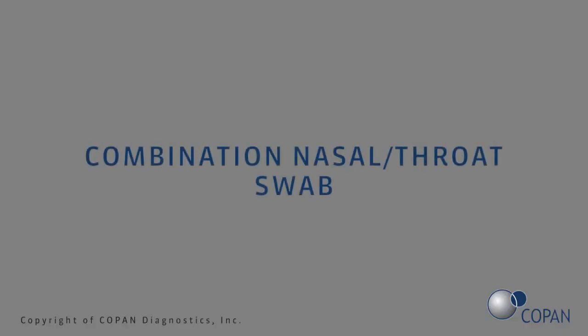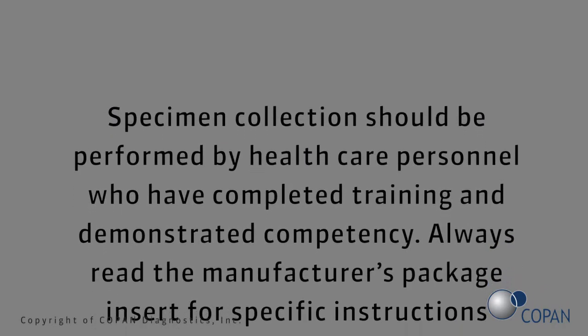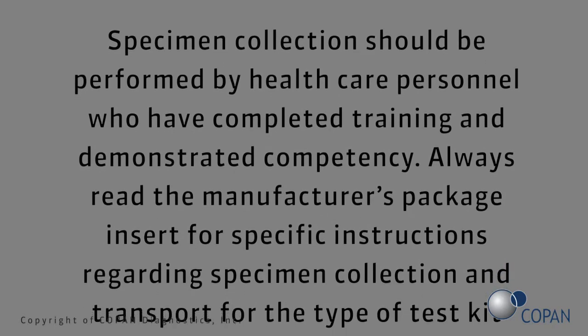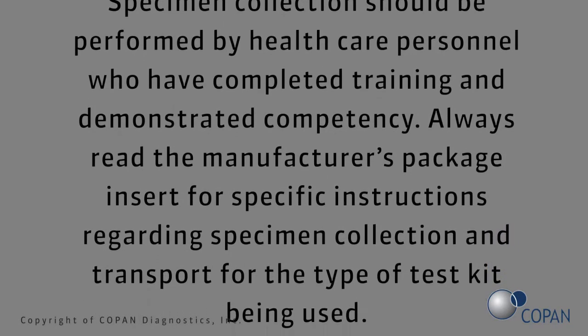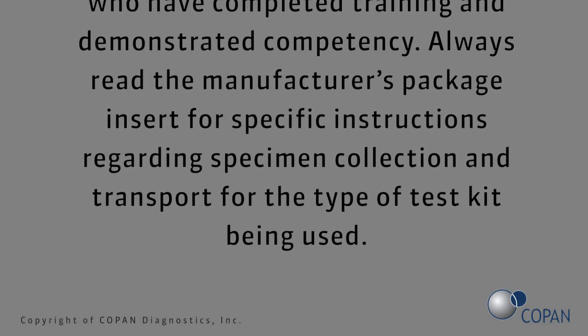Combination nasal throat swab. Specimen collection should be performed by health care personnel who have completed training and demonstrated competency. Always read the manufacturer's package insert for specific instructions regarding specimen collection and transport for the type of test kit being used.